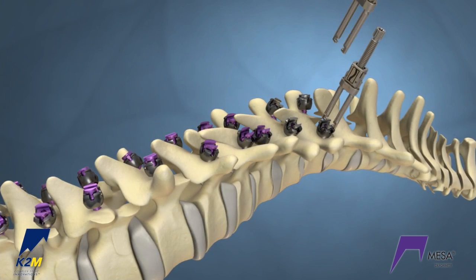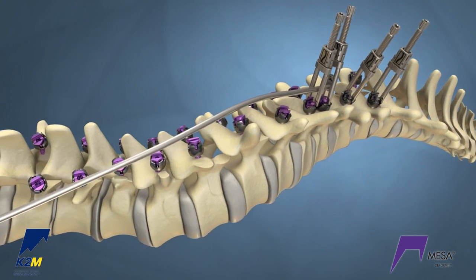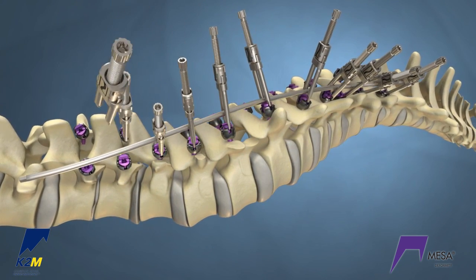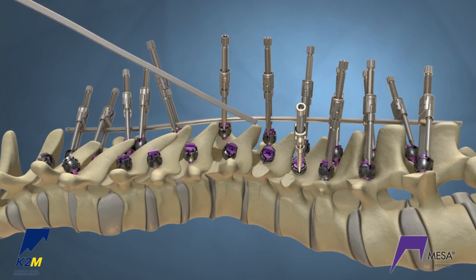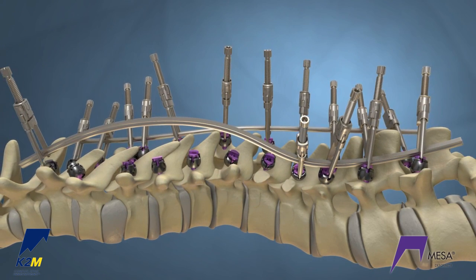Apply 4 crickets at the proximal end of the convex side of the construct. Then insert the appropriately bent rod through the crickets and loosely place the remainder of the crickets on the convex side. Starting on the concave side, place 4 crickets at the distal end of the construct. Insert the appropriately bent rail and loosely place 1 cricket at the top of the construct.